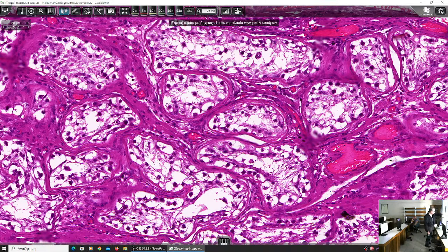They change their phenotype. However, if you find intratubular germ cell neoplasia, in situ neoplasia of germ cell, any tumor that is nearby is, by definition, malignant, no matter how mature its elements look like. This is not the same in ovaries. In ovaries, a mature cystic teratoma is benign.